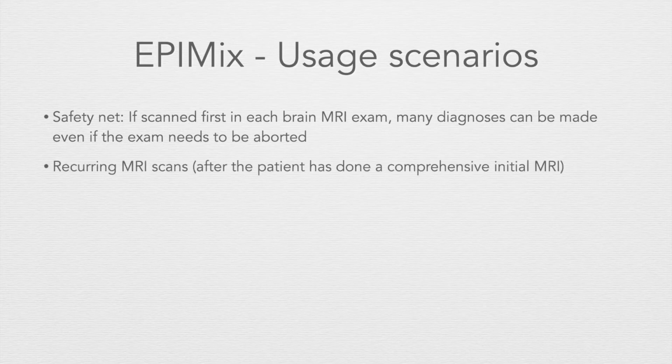Also for recurring MRI scans, this is something we are thinking about. We have not yet done this so much, but if you have a patient coming back for routine checkups, you may be okay with a less high resolution or comprehensive scan.